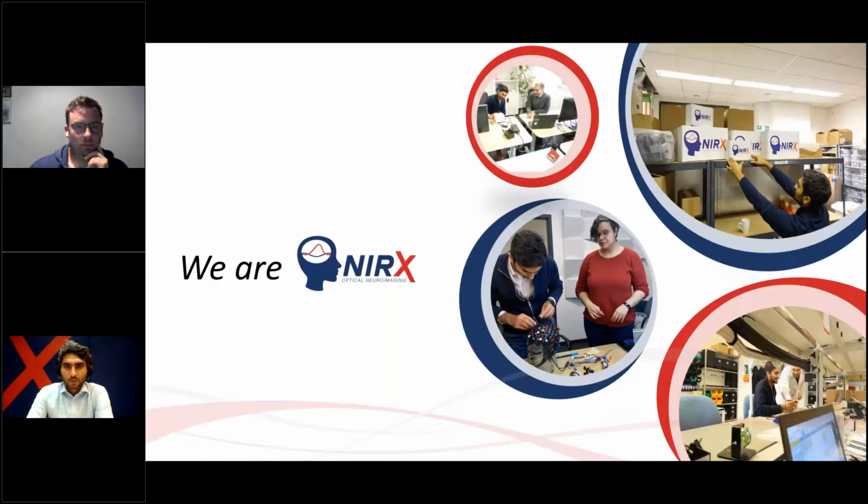And we at NIRx, we like the idea of giving our users the option to choose the platform of their choice. We do this by providing data in open source format, allowing you to analyze your data with our analysis software as well as any open source platforms. And we'll take a look at one such relatively new entry, the MNE toolbox, which will be presented by one of the developers, one of the most active developers, I would say, Dr. Robert Luke.